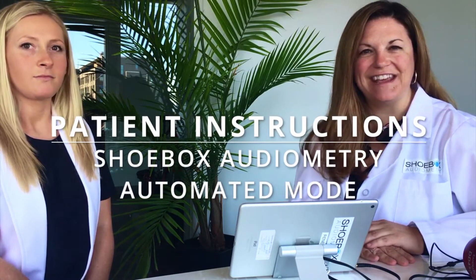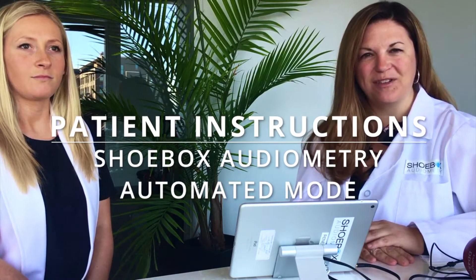Hi, my name is Renée LaFrancois. I'm the in-house audiologist here at Shoebox Audiometry. Today we're going to do a brief overview of instructions to patients prior to taking the automated mode test of Shoebox Audiometry.